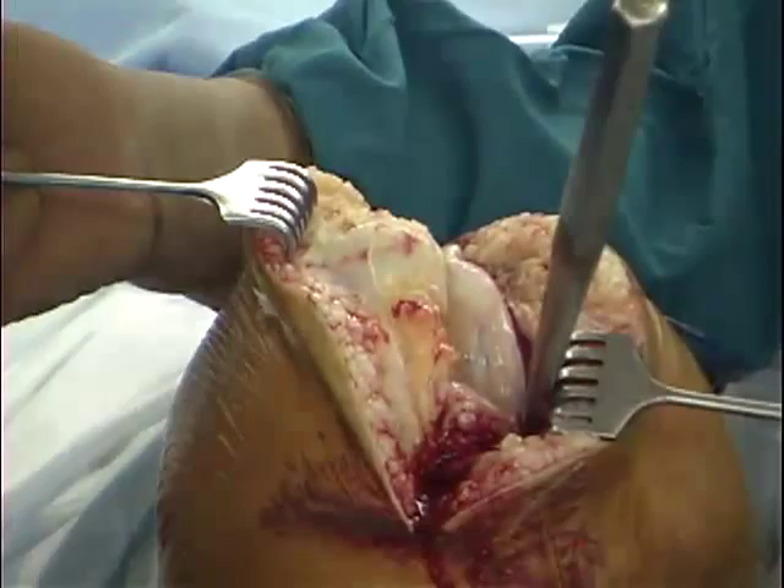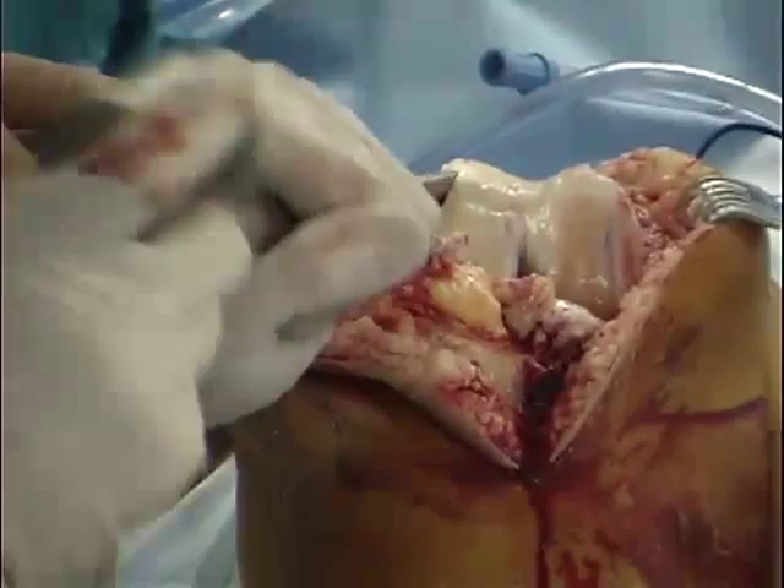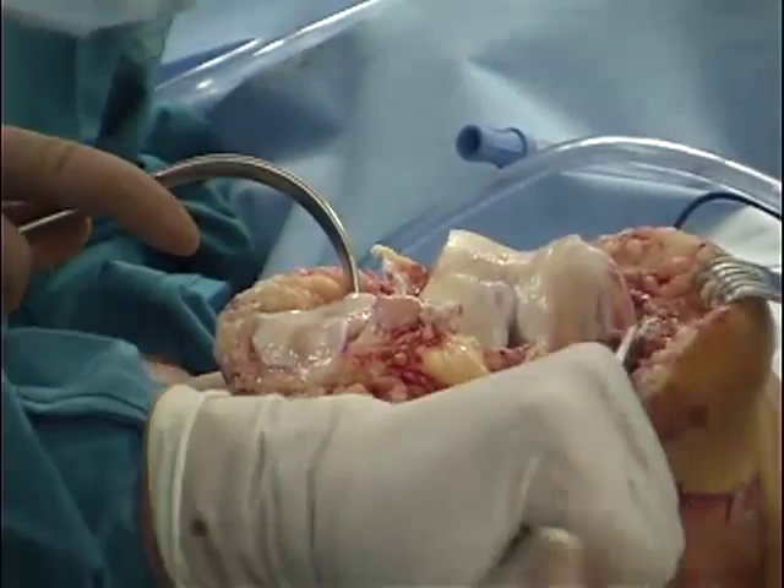One of the often neglected aspects of soft tissue balancing is to remove all osteophytes off of both the medial and lateral condyles to ensure that the collateral ligaments are not tented as they run from the femur to the tibia.